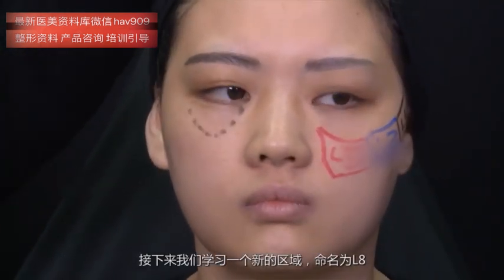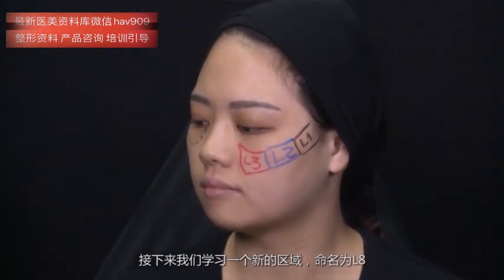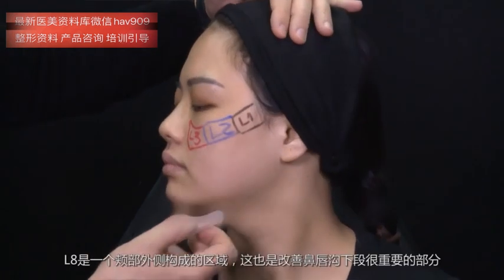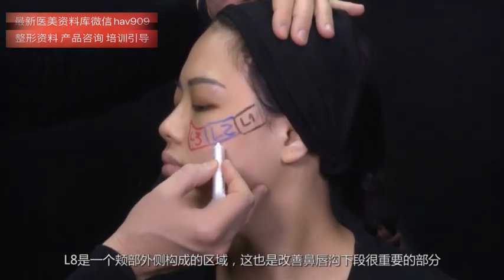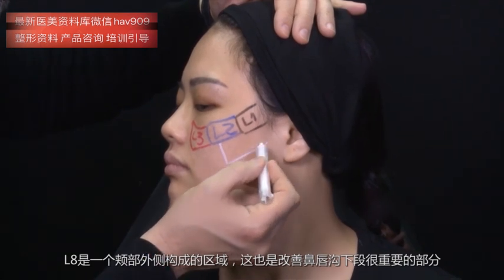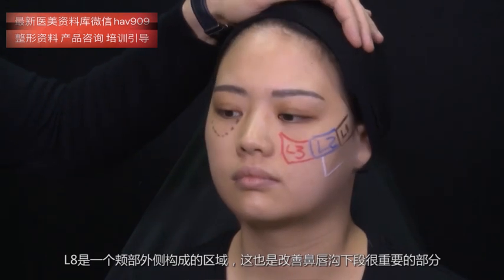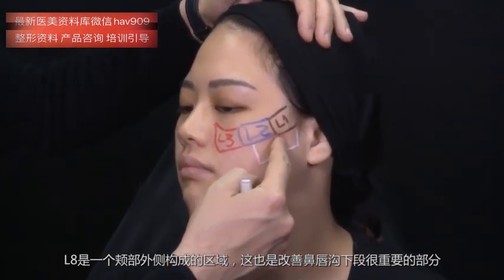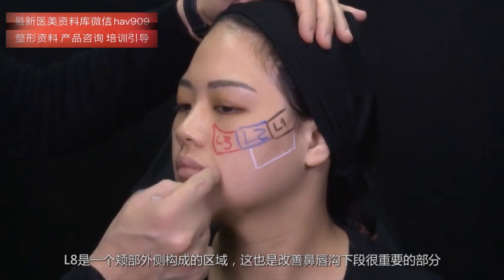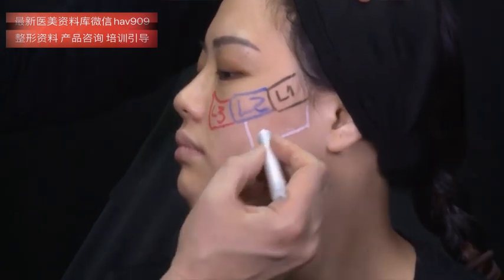Now, let's study a new area named L8. L8 is an area that comprises the lateral aspect of the cheek and is also important to improve the lowest part of the nasolabial folds.